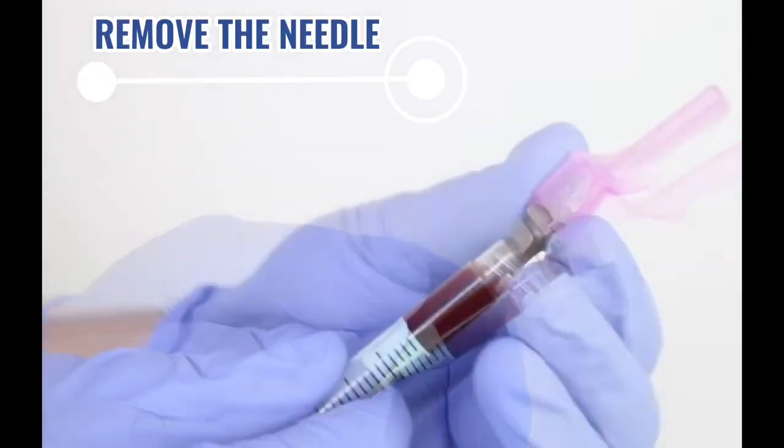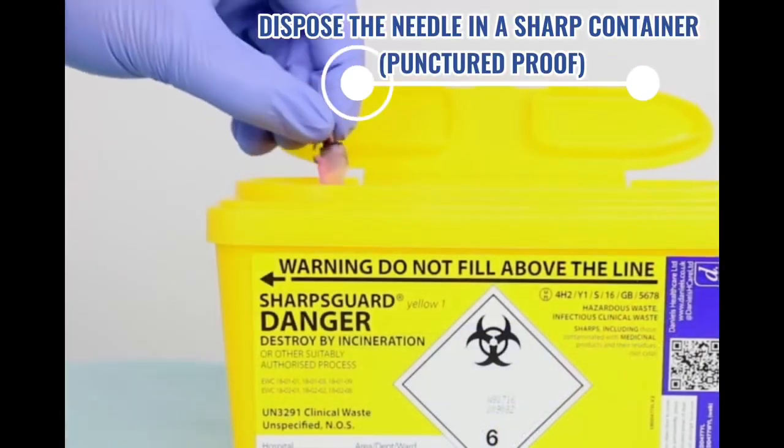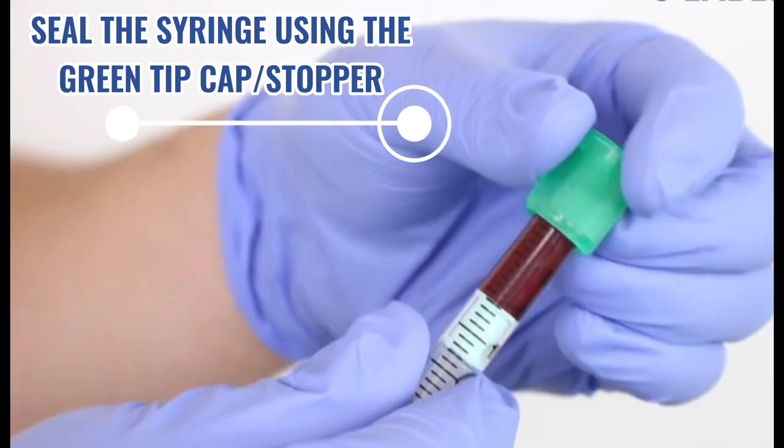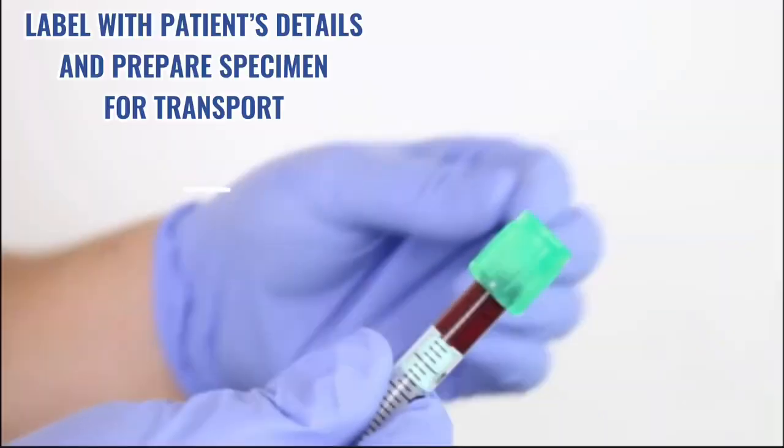Detach the needle from the syringe and dispose properly. Seal the syringe with the green tip cap or stopper. Label with the patient's details and prepare the specimen for transport.